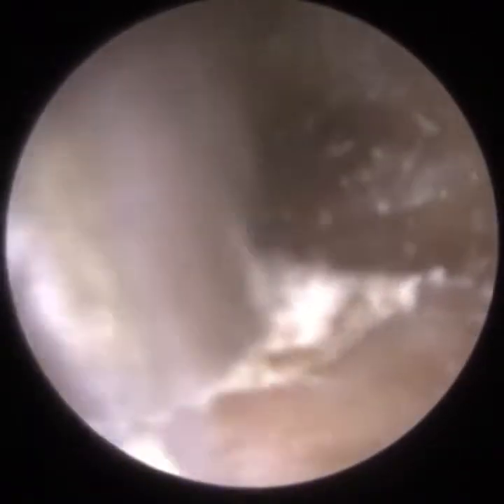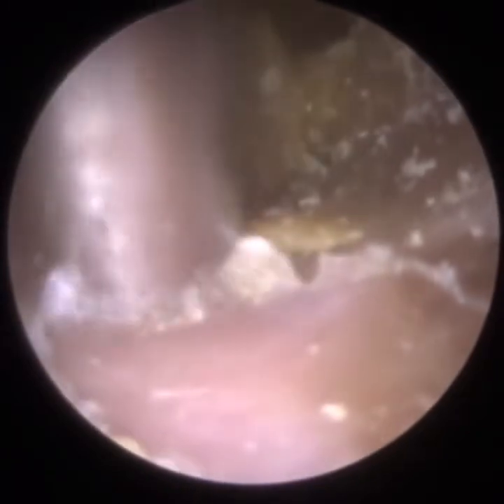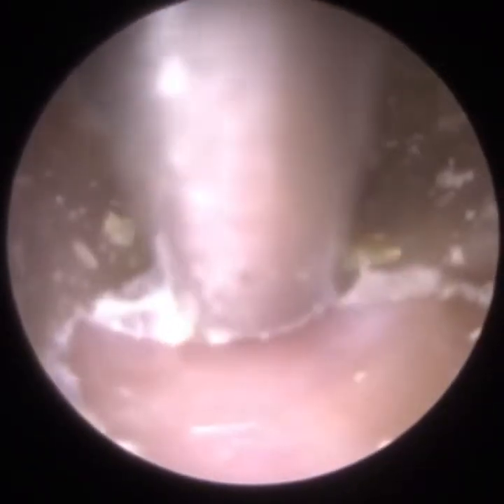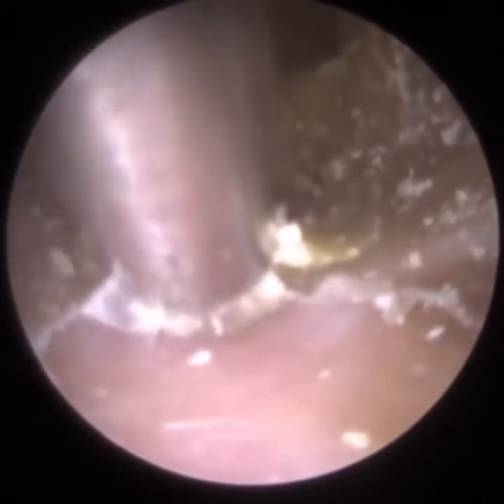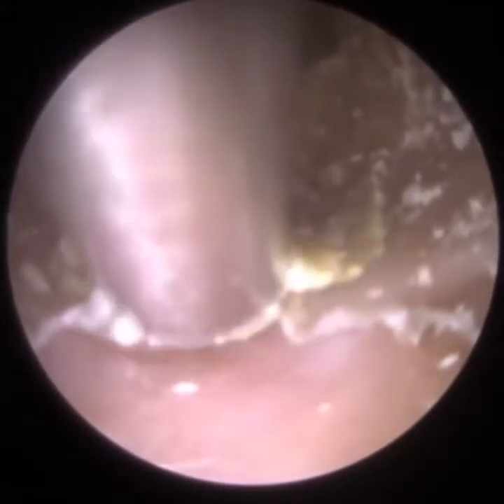And the issue with the patient's ear canal is that as the skin dies on the ear canal and also the outermost layer of the eardrum, because the outermost layer of the eardrum is composed of the same skin that lines the inner 2/3 of the ear canal, whereas in most people this skin would naturally migrate sideways and out of the ear. In this particular patient, this skin doesn't, and it just remains attached to the ear canal and eardrum. And you can see here the skin has become really hard and crusted.